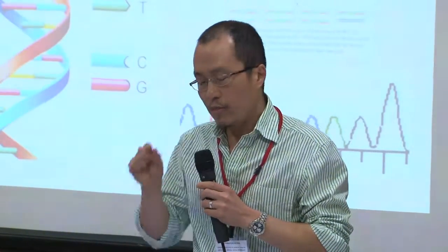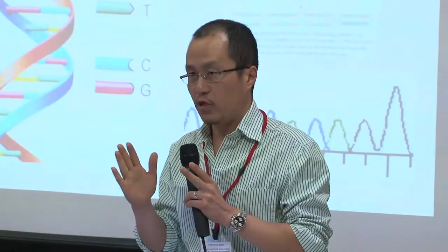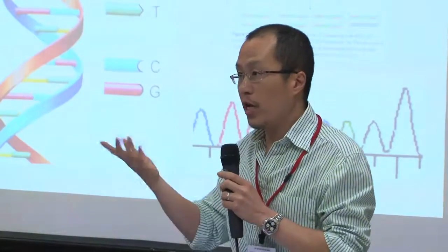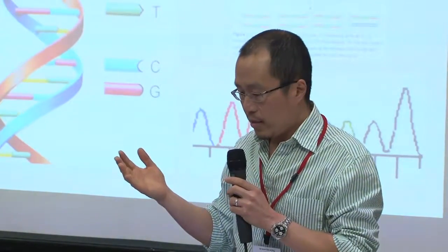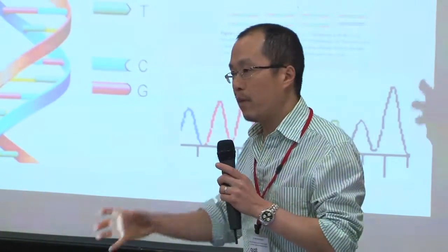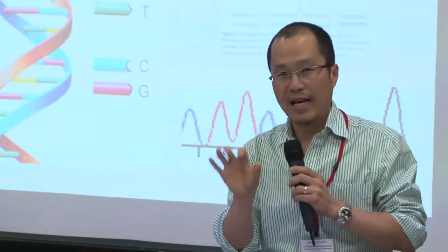We are interested in certain parts of certain genes, which I'll talk about in a second. Those parts are called exons, little parts of genes. And we are interested in mutations where the genetic code is changed in some way. So the way that we study or look for those mutations is to amplify lots and lots of copies of that particular exon.